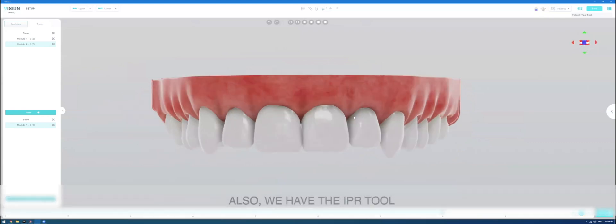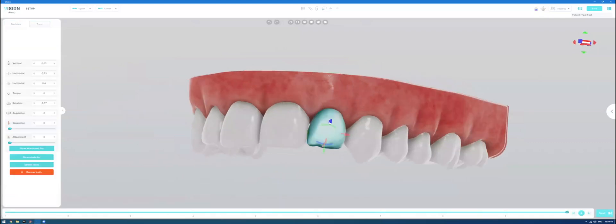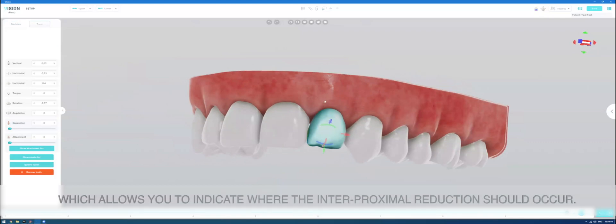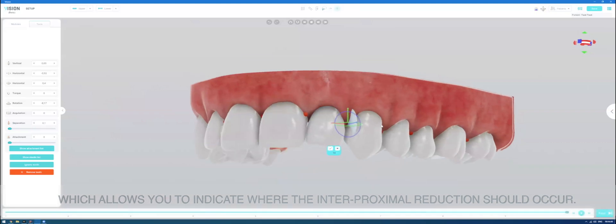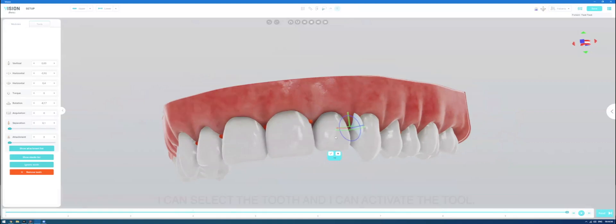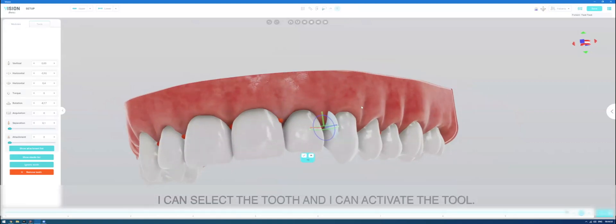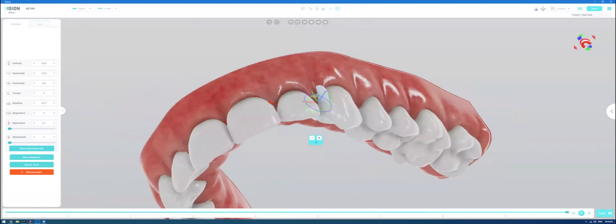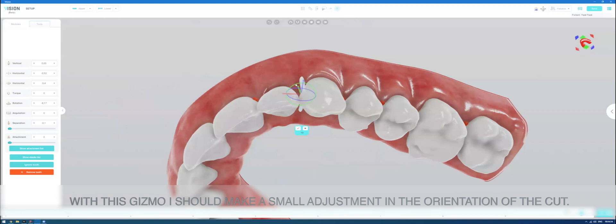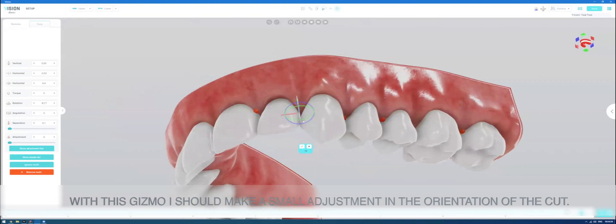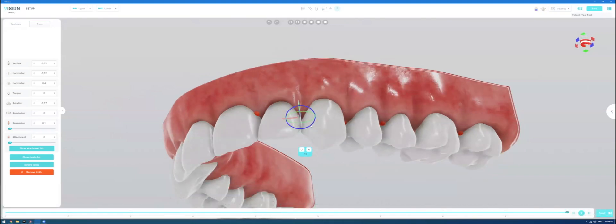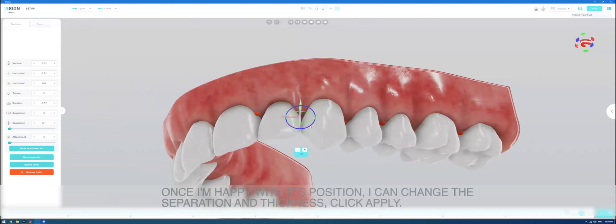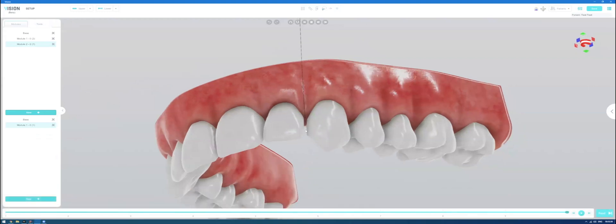Also, we have the IPR tool, which allows you to indicate where the intraproximal reduction should occur. I can select the tooth and I can activate the tool. With this gizmo, I should make a small adjustment in the orientation of the cut. And once I'm happy with its position, I can change the separation thickness.